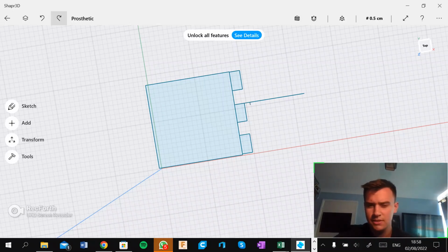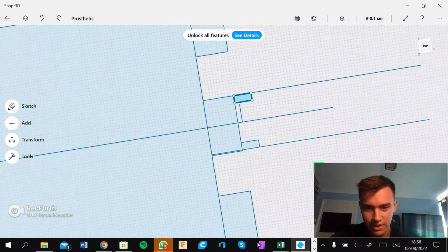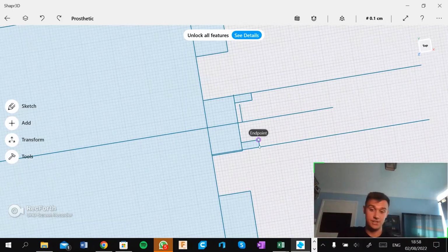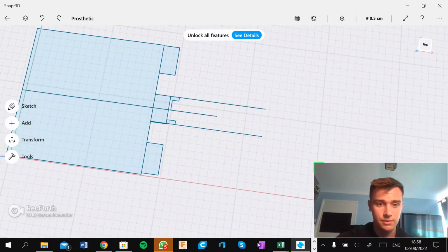And yeah, so I decided on 9 centimeters to begin with. However, I quickly realized that would not be long enough. Actually, I realized later, but we'll see. And so I'm using these 2 there. They're going to be the start of a hinge. So the outside, and it would hook on into the middle of the next joint. And that's my plan for how I was going to do that.